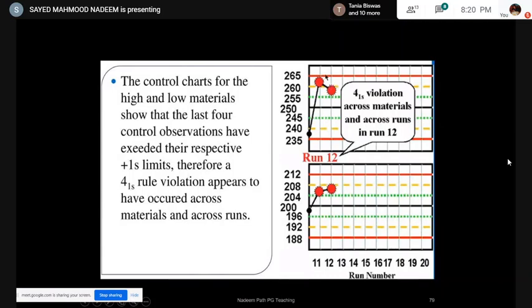Now you can extrapolate this on your analytical curve and try to see that even the lower one third and the upper one third is showing a positive 1 SD bias. So most of the results which you are releasing of your patients will be on the higher side.